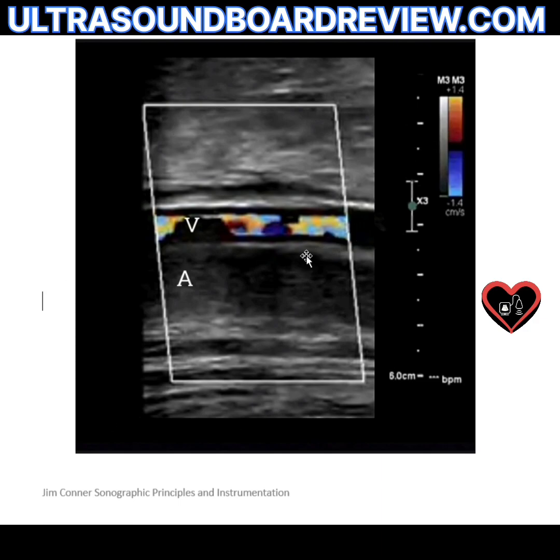A lot of people look at this image and go to fix the aliasing in the vein — they increase the PRF, scale, Nyquist limit, and lower the frequency. But that doesn't fix the missing color Doppler in the artery.